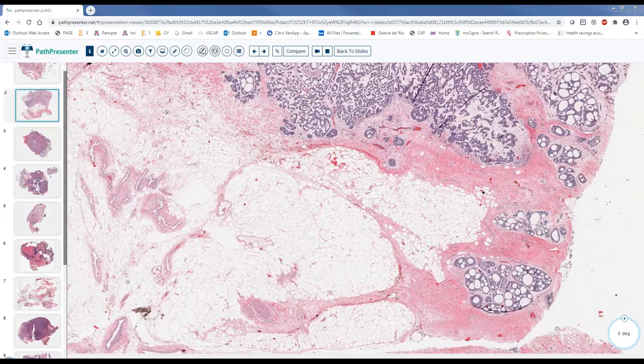So if you have glands in the fat surrounding the prostate, that is not normal. That is adenocarcinoma, even if they look very well differentiated. The same thing for prostate: beyond that capsule or pseudocapsule, if you find tumor in the fat, that is not normal. Here, you cannot define it except by radiological examination, where radiology says it is out beyond the gland, or by gross examination, where you see that grossly. But if you find tumor in the fat in salivary gland, that doesn't make extra parenchymal extension.